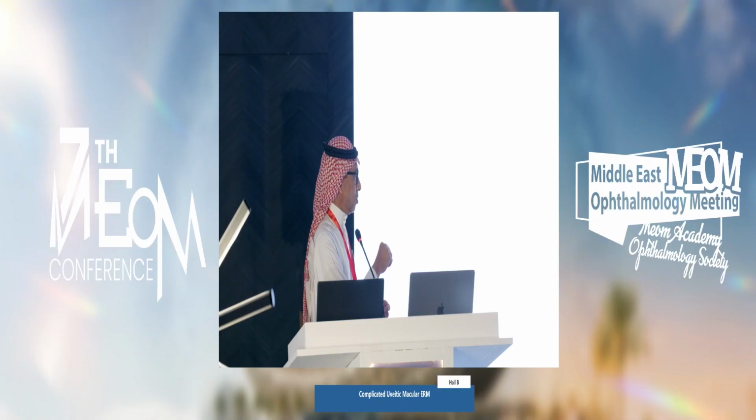Would you insist on ILM peeling in those cases? I mean, we know there is a higher risk of recurrence if you leave it, but I have seen post-uveitic cases where, after removal of the ILM, they actually develop a macular hole. And at that stage, it will be difficult to manage. Yes, but being attentive to this patient, who is complaining of poor quality of vision, and this membrane is thick and fibrous, not like a regular membrane.